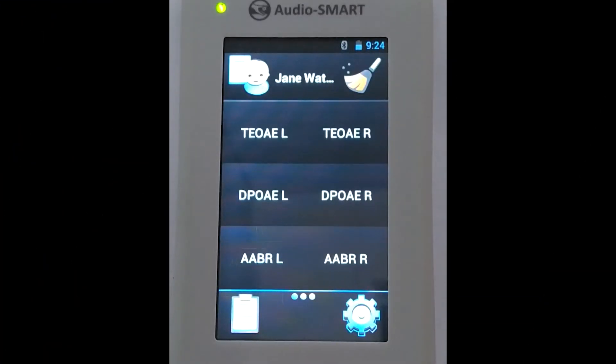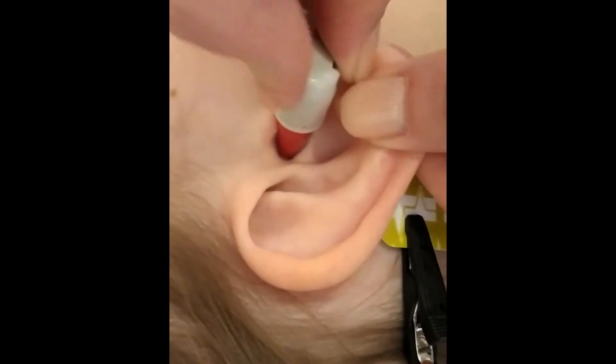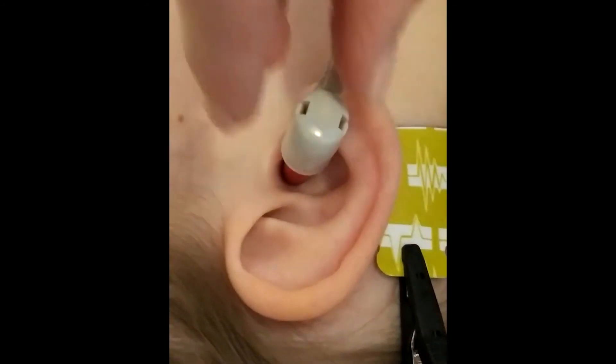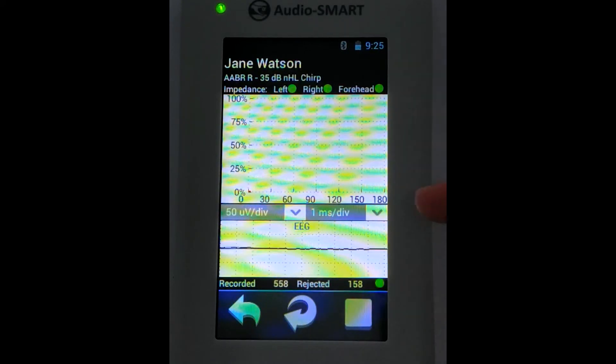Now we are ready to register the automatic ABR test. We need to choose the site of stimulation where we have positioned our probe. The system reveals the quality of electrode positioning and probe positioning. Now we are in the registration window. We can see the native EEG signal at the bottom of the screen, as well as the quality of electrode positioning — it is good. All answers with higher amplitude suspicious as artifacts are rejected.